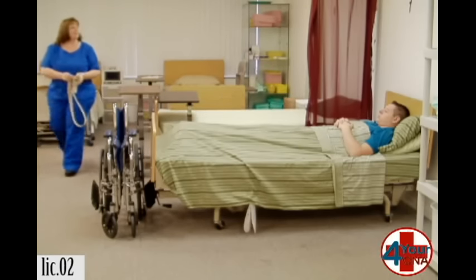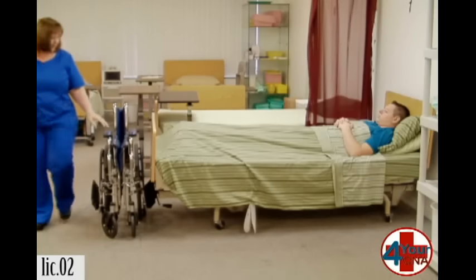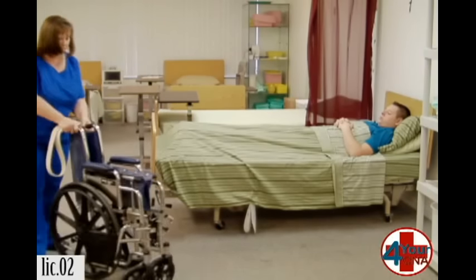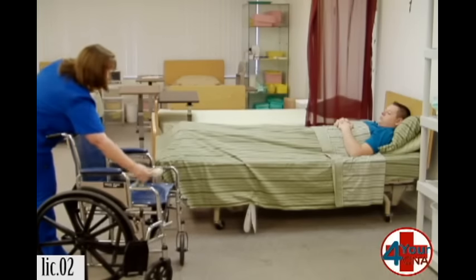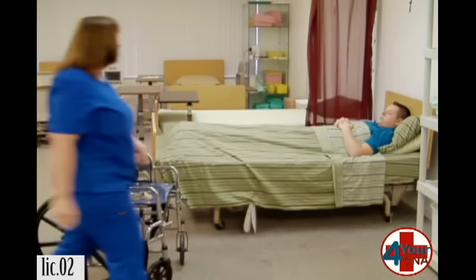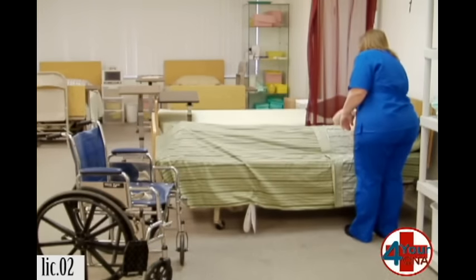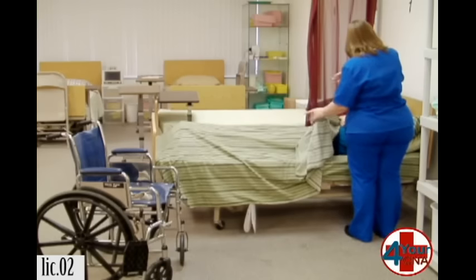So how are you feeling today? I'm okay. Are you dizzy at all? Or weak? Let me get everything set up here. I'm going to pull the sheet down to the end of the bed, and that way we can get you sitting on the side. Okay.